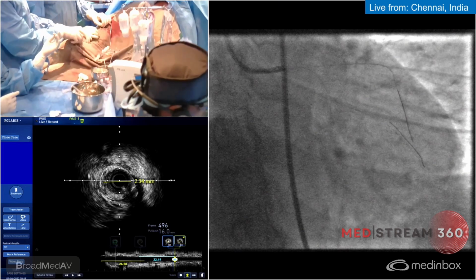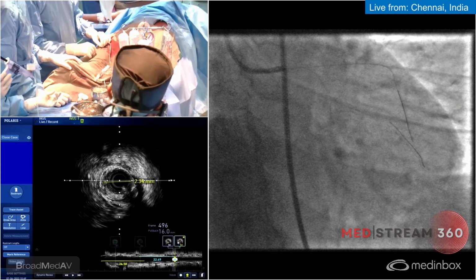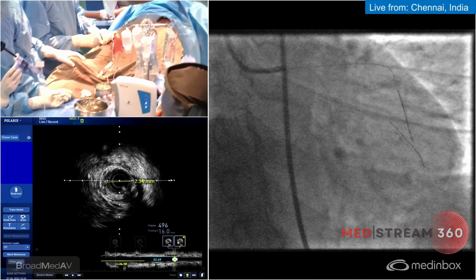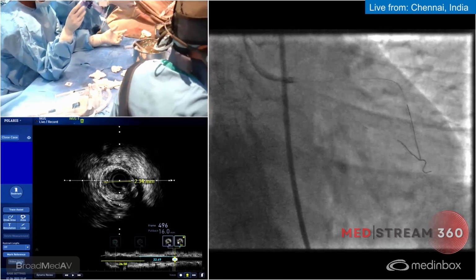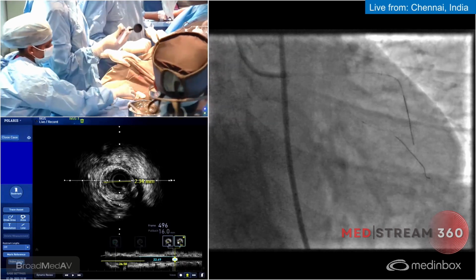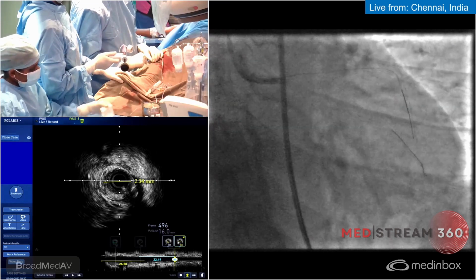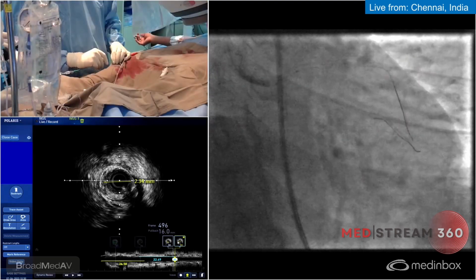Do you think a 2.5 will be good, or a 2.25? We will take 2.25 because distally diffuse disease. Okay. So 2.25, 22 Onyx, I think, which we can push up to 3.25. Okay. Then the overlapping stent, maybe next we will take 26 or 28. It depends upon the IVUS pullback. Okay, good. So we've got a small balloon to just pre-dilate it.